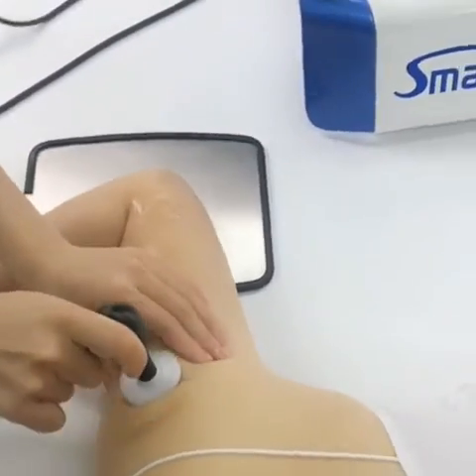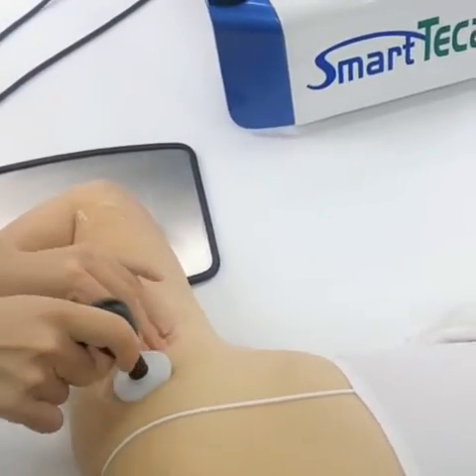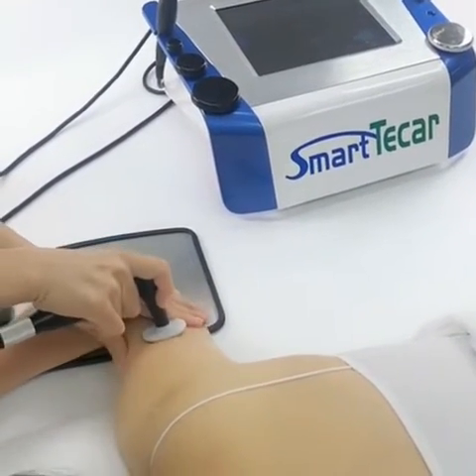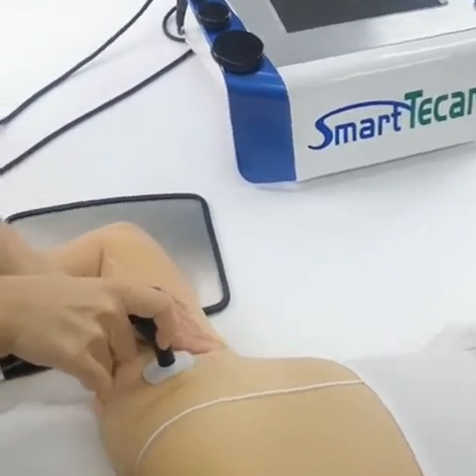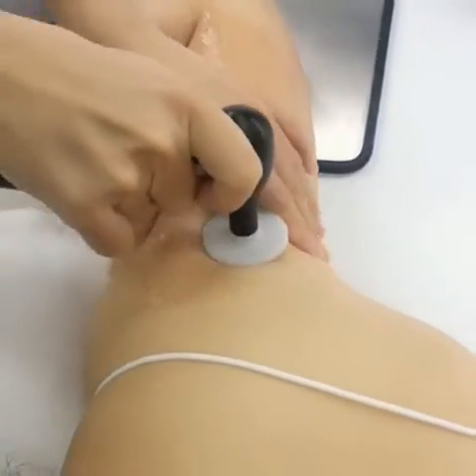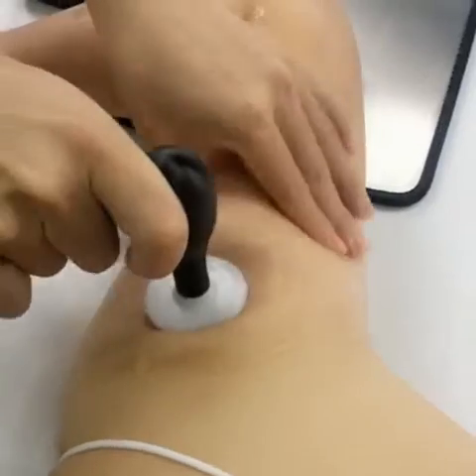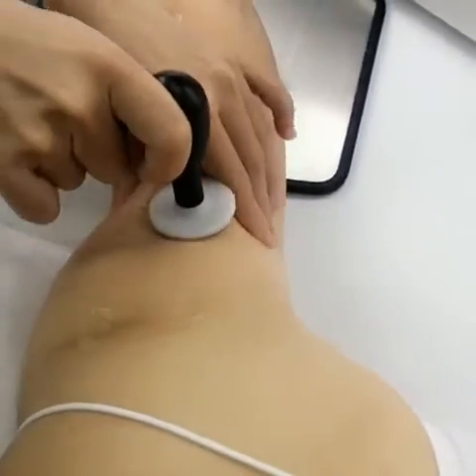The intensity can be adjusted appropriately by the user. As we are moving around the target region, the energy is released only in the deeper tissue layers and converted into heat without energy loss. The deeper penetration of resistive energy transfer can reach 10cm.